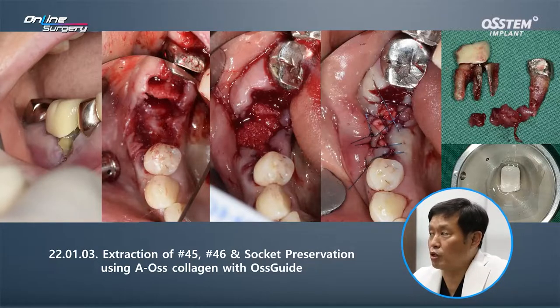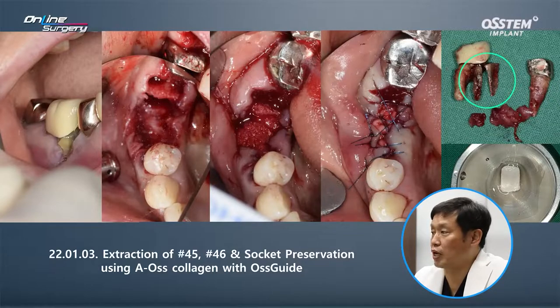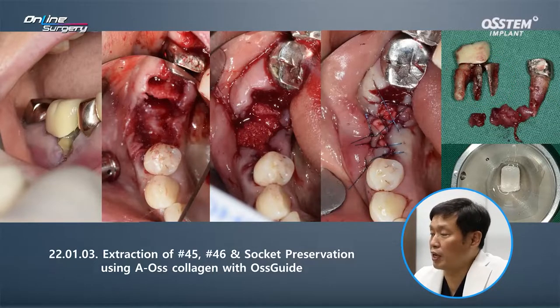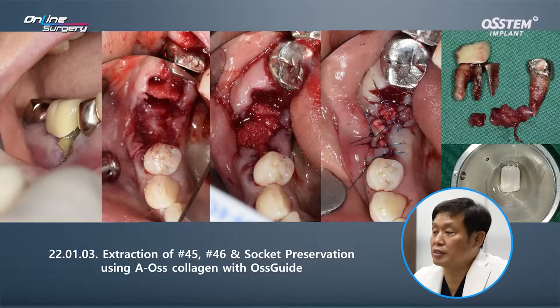After extraction, there was granulation tissue and fractured root. AOS collagen was used and irrigated first before being used for socket preservation.